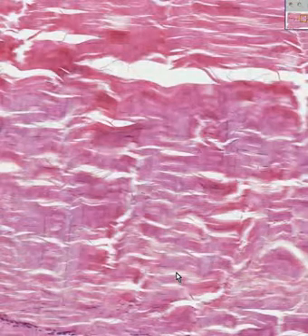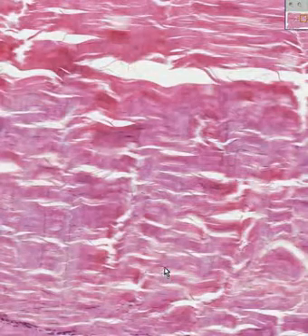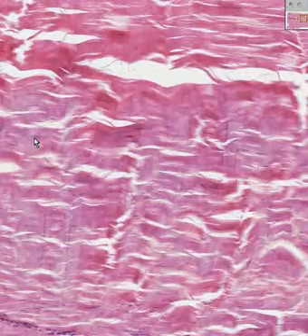So, like loose areolar irregular connective tissue, this is chiefly collagen, the pink stuff, and these spindly cells, which are the nuclei of the fibroblasts, which makes the collagen. But in difference to loose areolar connective tissue, these collagen bundles are much more dense. And in addition, both the fibroblasts as well as the fibers are arranged in one direction. They're linear. This is a type of dense connective tissue in which the force is placed on it only from end to end. This is a tendon.